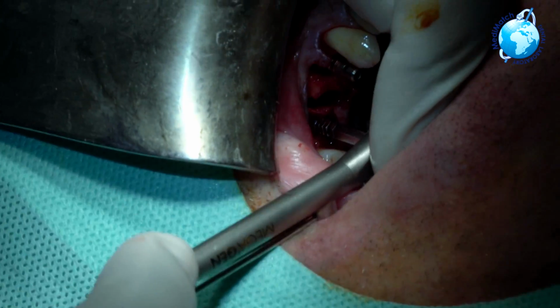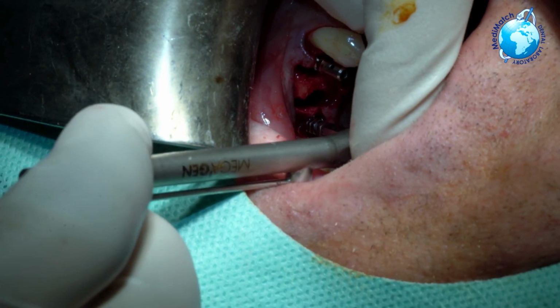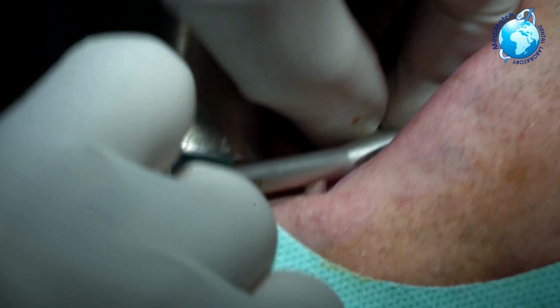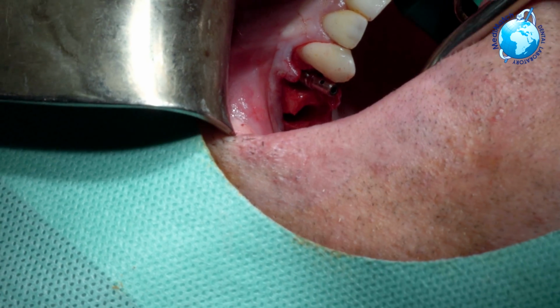Mate, have you seen this? Look, it's solid. Scottish bone. It's beautiful. Right, so I'm quite happy with that. It's just crestal placement over there. Quite happy with the prosthetic position for a bridge.